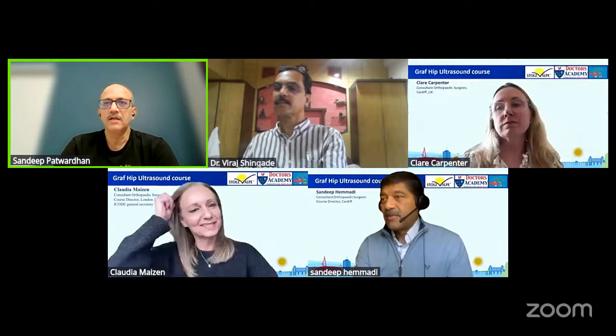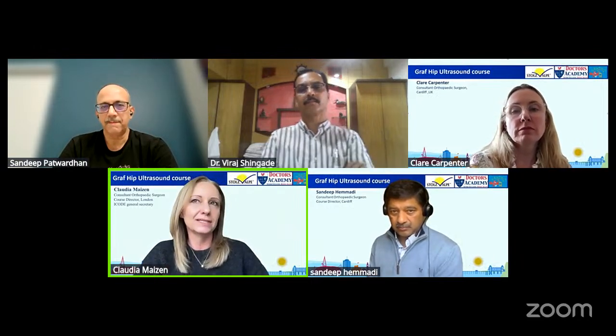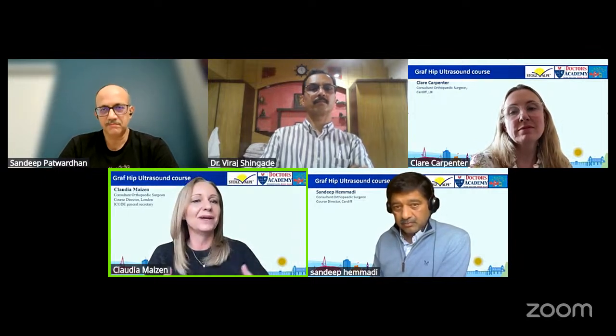Yeah. Just a quick one on AI. I think AI has definitely the potential to take over on that end. But you need to understand the differences between a proper standardized picture to understand what the AI model is actually giving you. So you have to understand what pictures this AI model is based on. And we know there are AI models out there that are sort of claiming to do the Graf method, trained on the Graf method, but they don't even recognize the chondro-osseous border, okay? So we have to be very careful what AI model we are using.